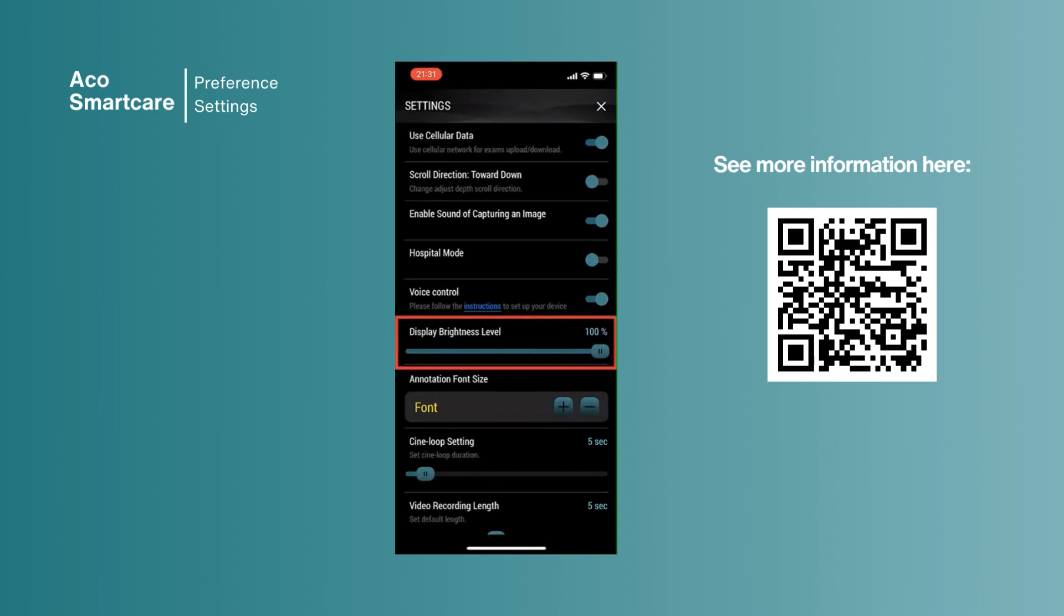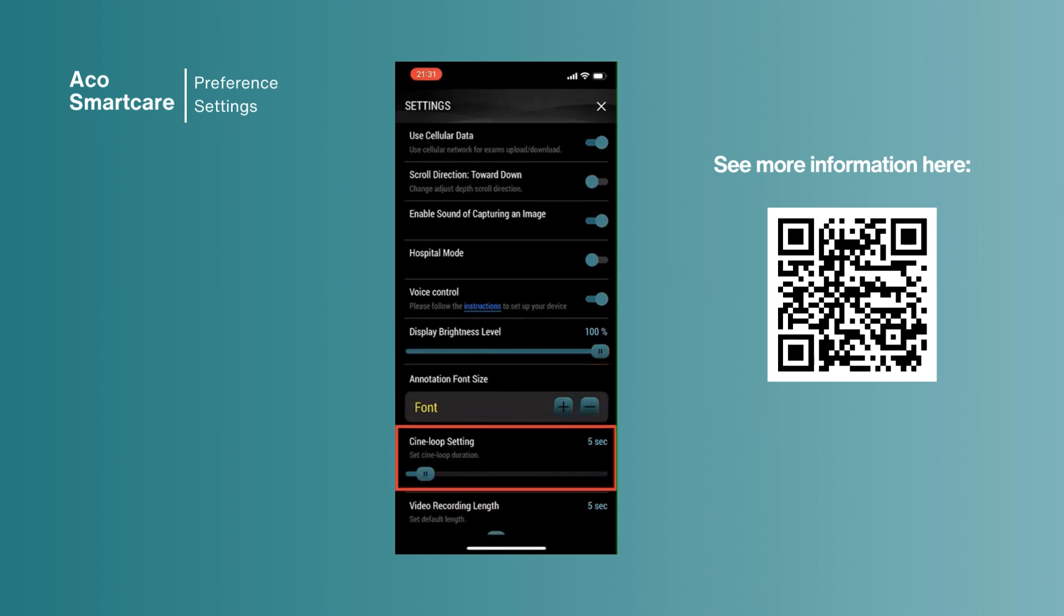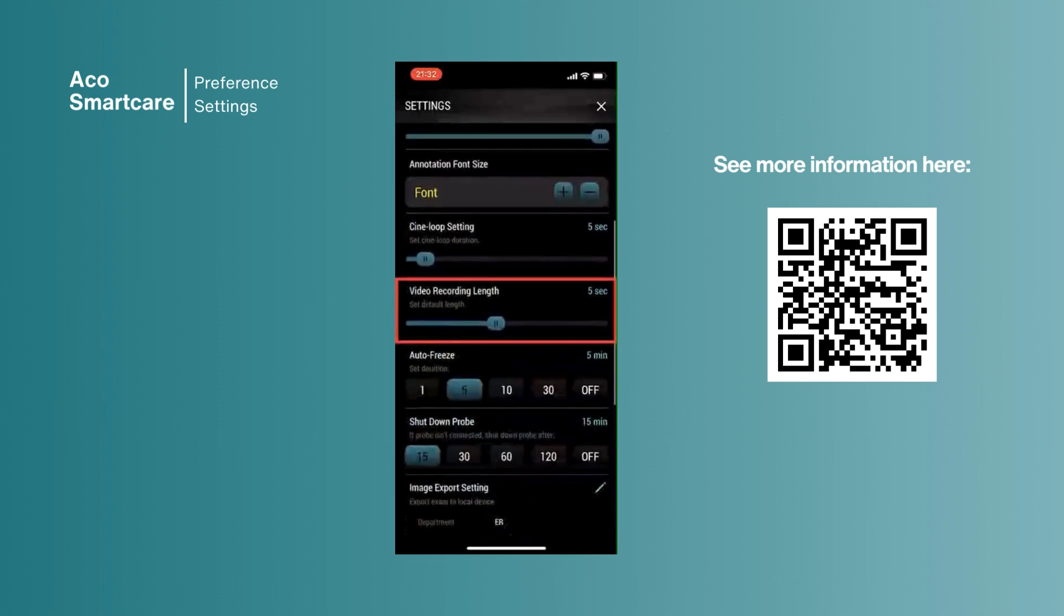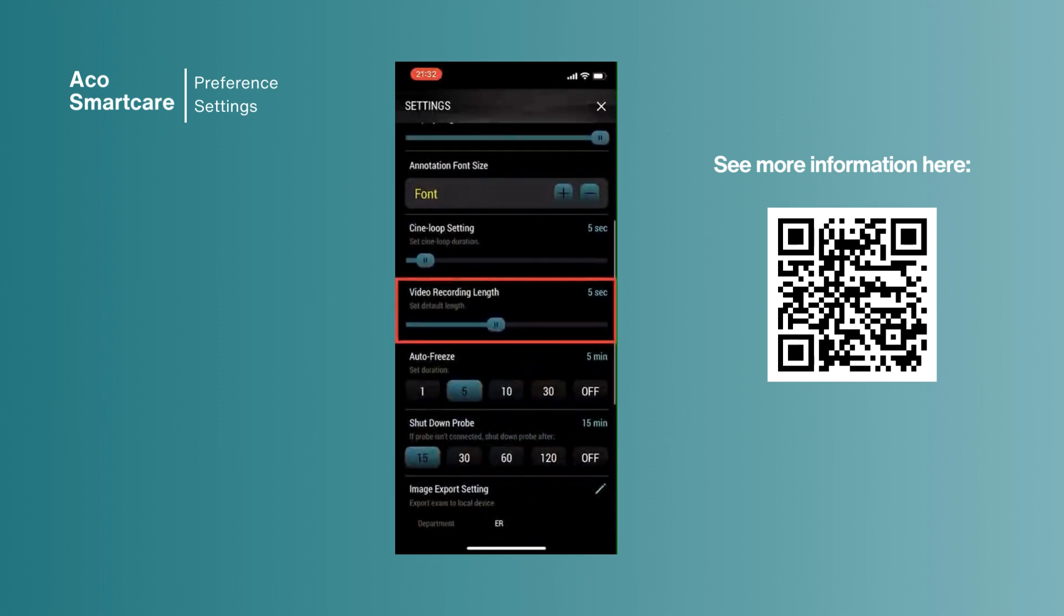You can adjust the font sizes. Cine loop setting can be set to 60 seconds and you can choose to video record up to 10 seconds length.